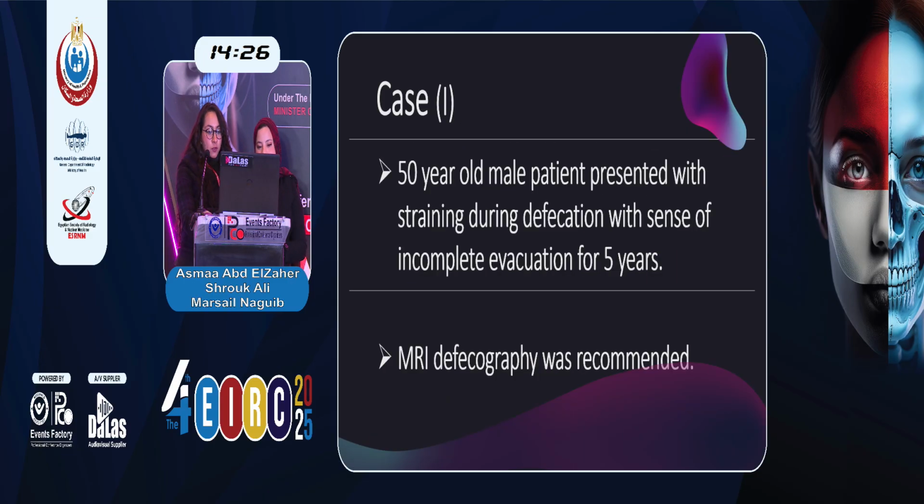And today we have two cases. My first case is a 50-year-old male patient presented with straining during defecation with sense of incomplete evacuation for 5 years. We recommended MR defecography because the evacuation phase gives us a crucial insight into the underlying mechanism of each patient's symptoms.